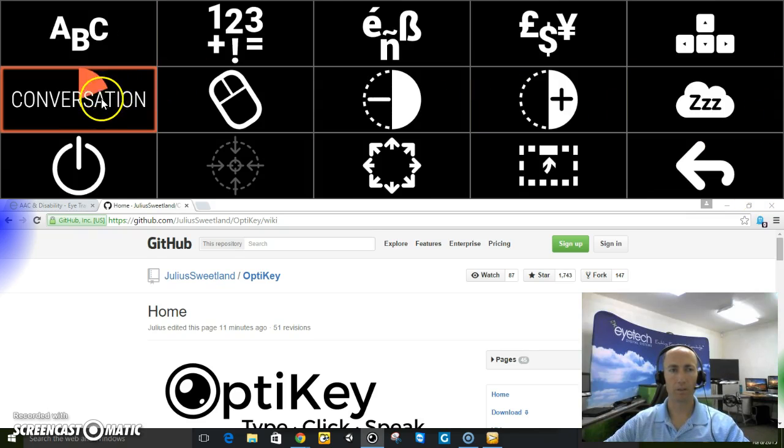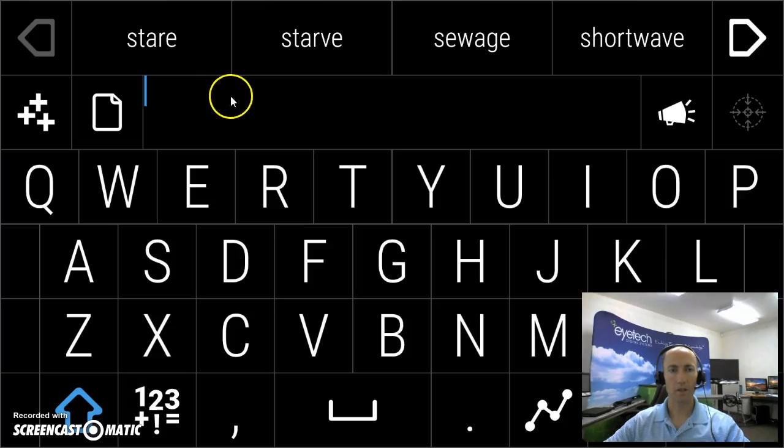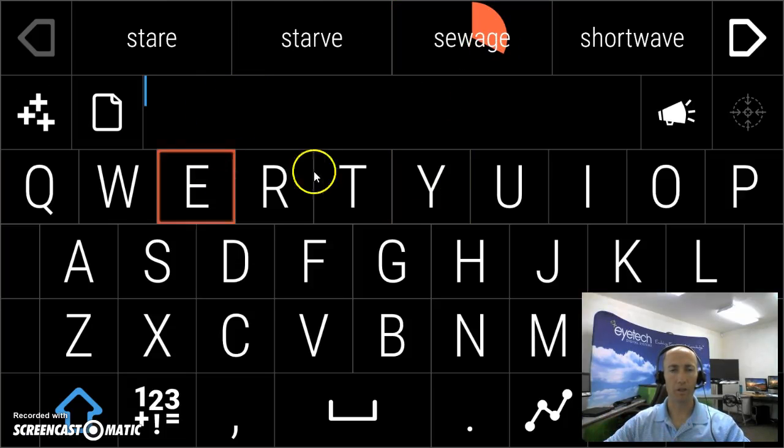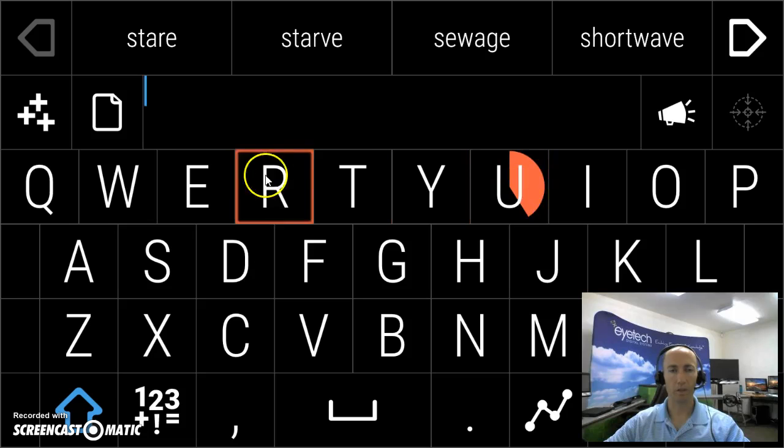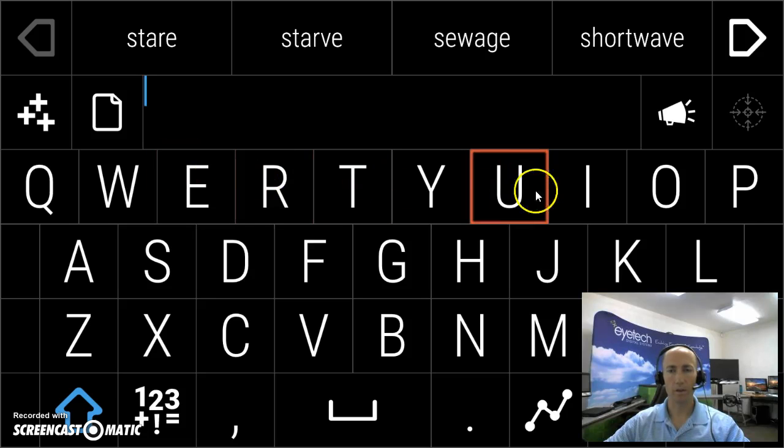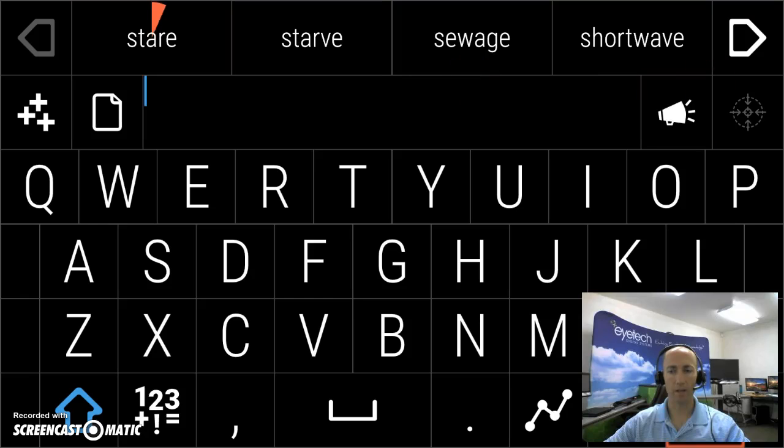One of my favorites is this conversation. It automatically makes the on-screen keyboard take up the entire screen. So it's really fast and accurate for eye gaze. I can go back.